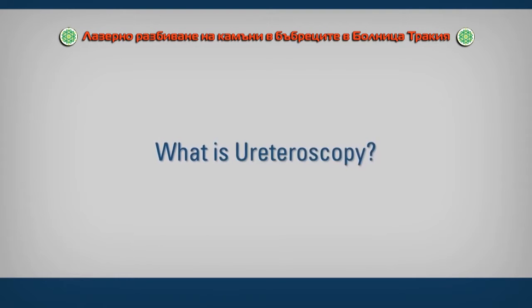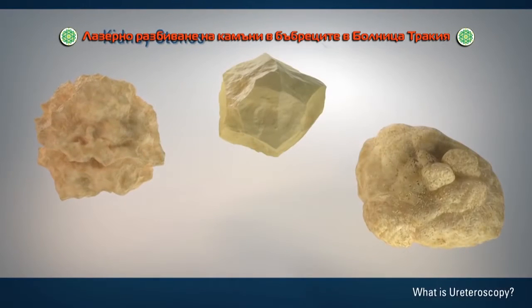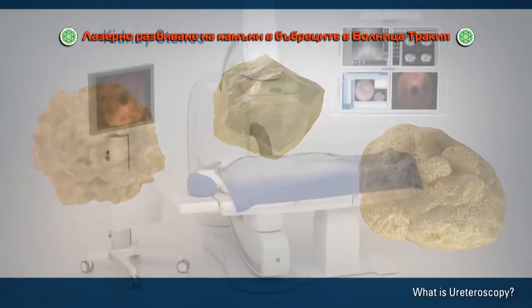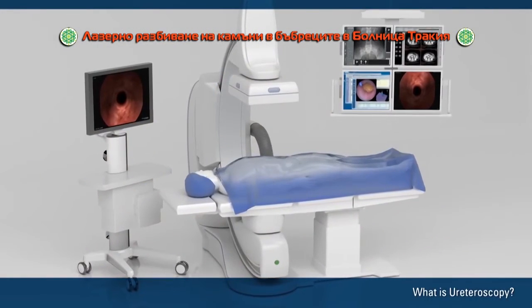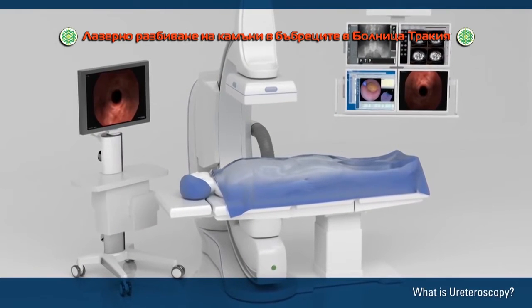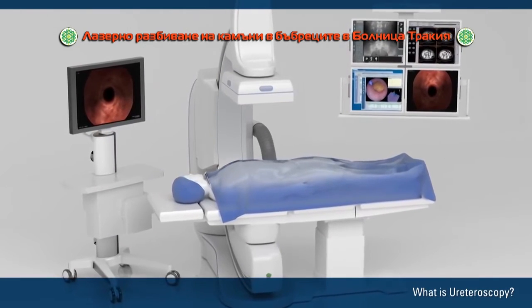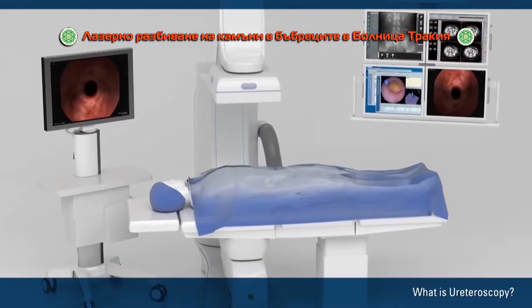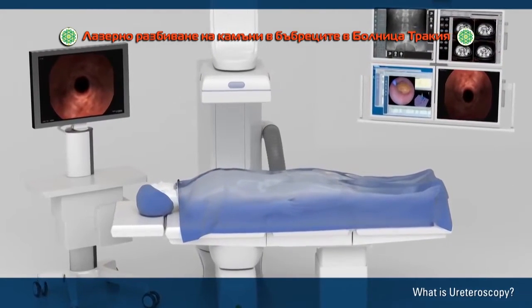What is ureteroscopy? Ureteroscopy is a type of surgery to treat kidney stones. A surgeon does the procedure in a hospital operating room or an outpatient surgery center. Ureteroscopy usually takes 30 minutes to 2 hours. The procedure typically requires anesthesia.